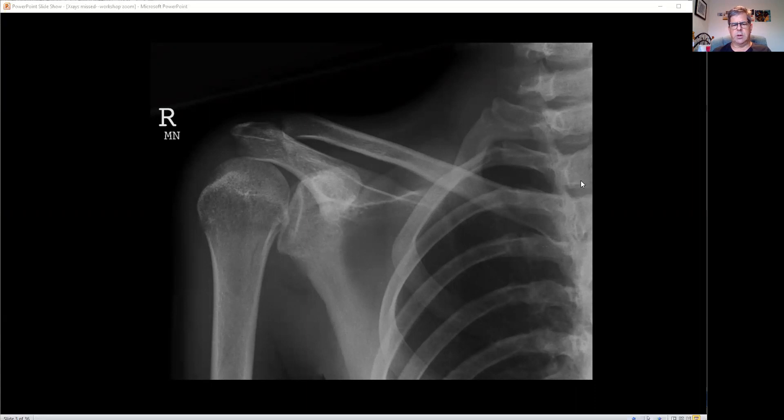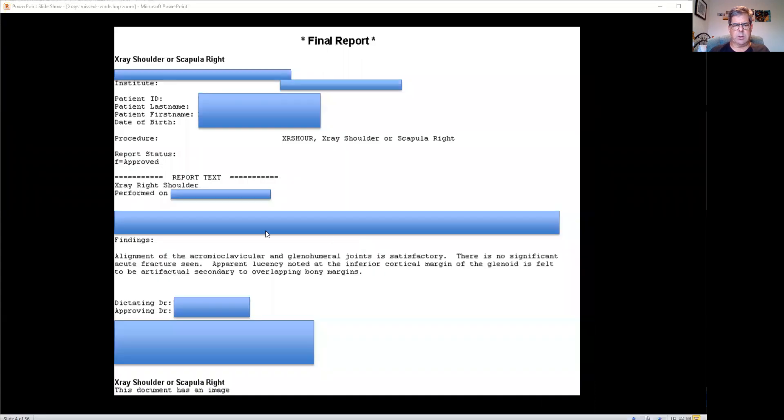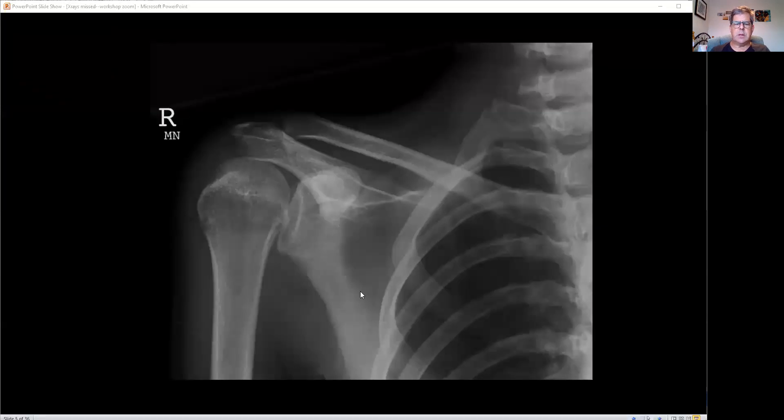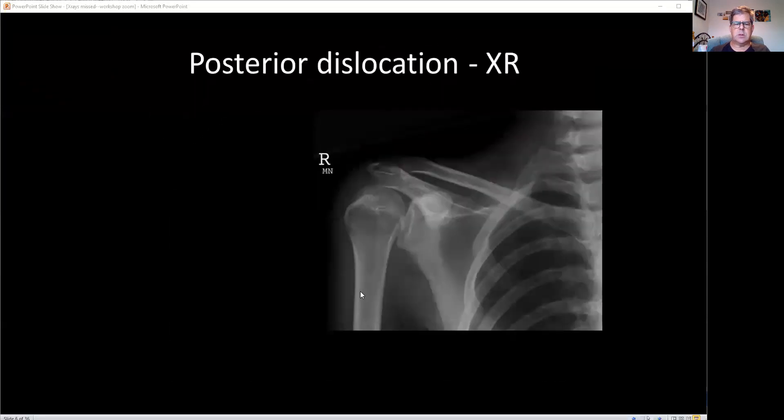I'll leave you a little bit of time to contemplate it. The AC joint looks okay, the clavicle looks okay, I can't see any fracture through the scapula. But this looks a bit abnormal. The actual report said: alignment of the acromioclavicular and glenohumeral joint is satisfactory, no acute fracture seen. Well, it's true — there's no fracture. So what is it?